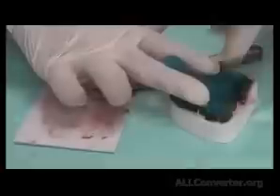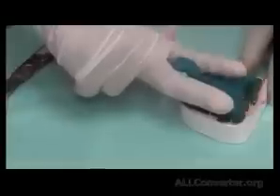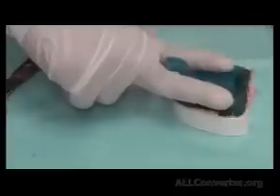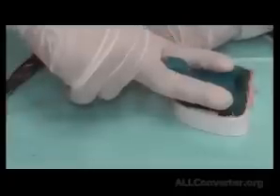Remember the rule that we maintain pressure all through the setting of the material. We maintain pressure over the tissue, and at this stage we let the patient do all of the border movements all together. We first tell them, do like a whistling, so he will be sending his lip and stretching the lip.